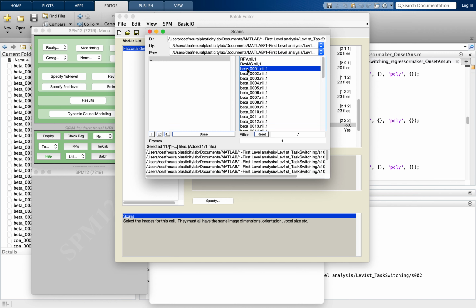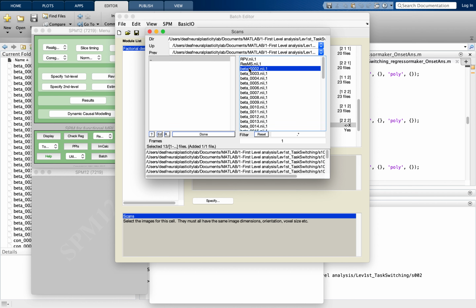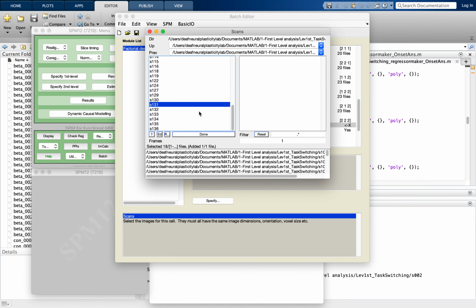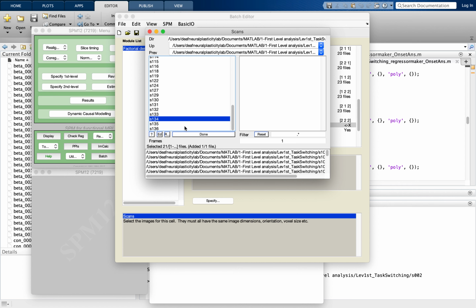It's not something that will vary across your participants. It's a very basic response of the brain, right? So if this is not working, that means that there is definitely something wrong with your analysis, or with your design, or the way you included the files in your design. So this is a nice way for us to check if our design is working. So 2 participants left.